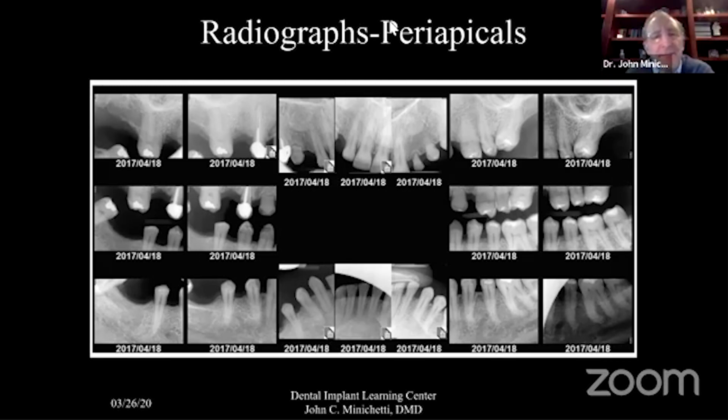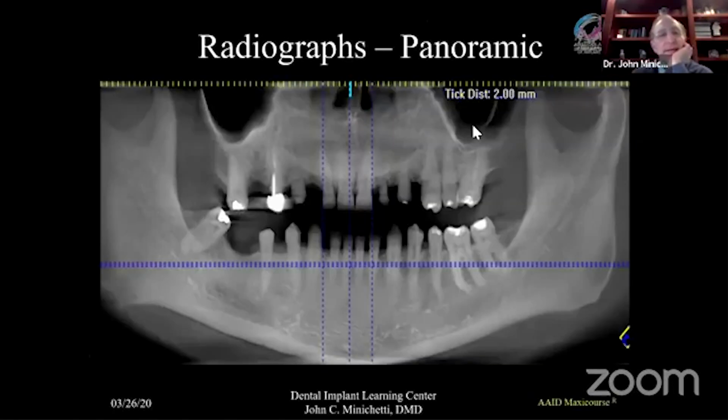Do I have a full 3D image? No, I really don't have. I do, but it's in the next slide when we're starting to diagnose. So I'm going to apologize about that. Siebert's class 1, absolutely. These are the type of diagnoses we want to have. Not only do we have the MISH diagnosis, but we have Siebert's diagnosis 1, 2, and 3. Excellent, excellent, excellent. Okay, so you guys are on the ball.